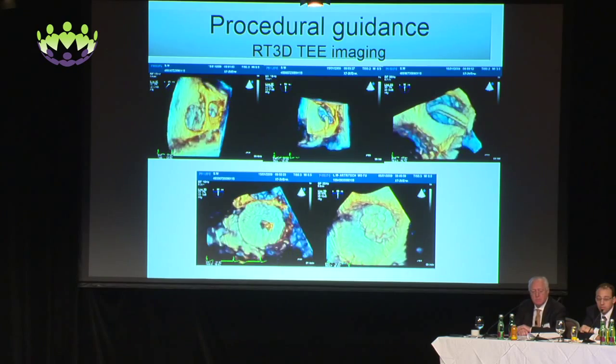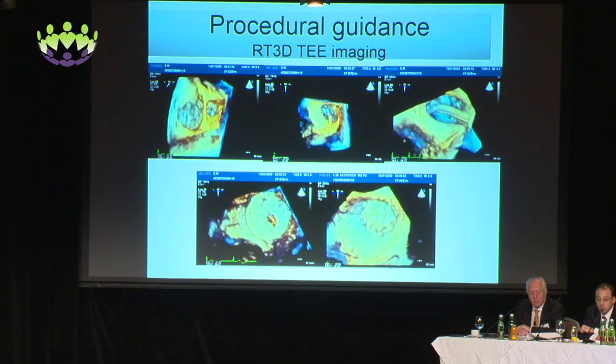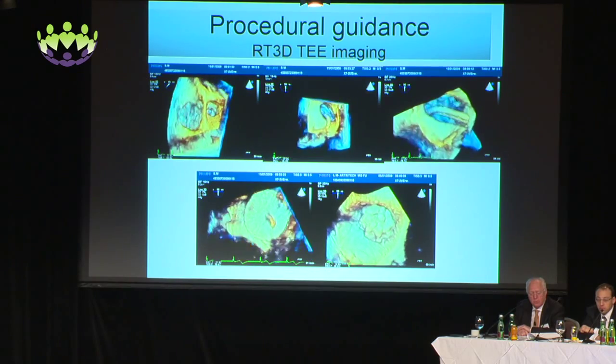So for the procedural guidance, this is an example in 3D TEE. What steps do you have to monitor? This is the opening of the left atrial appendage.